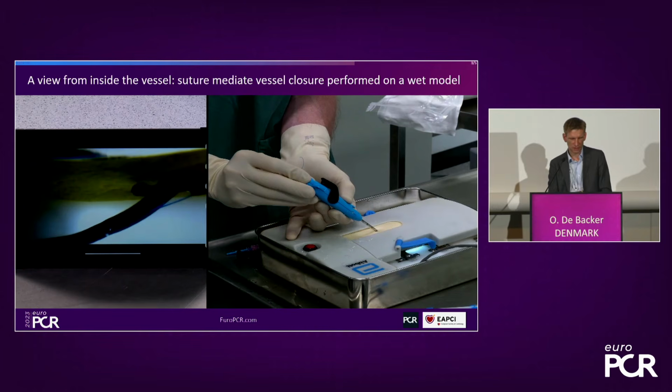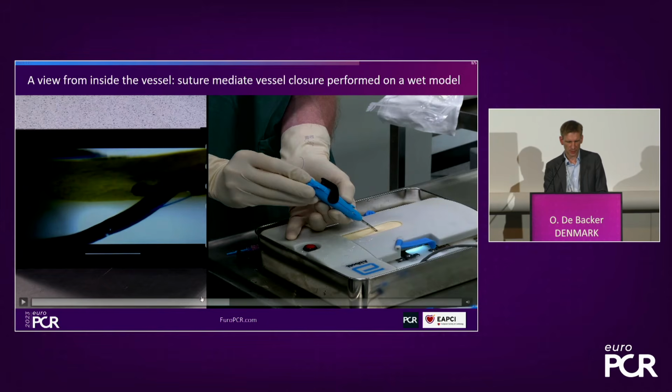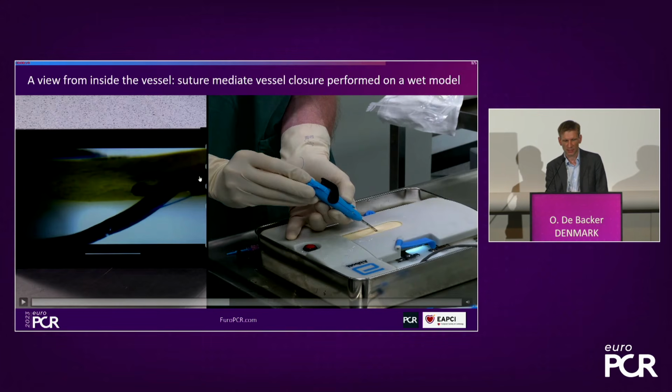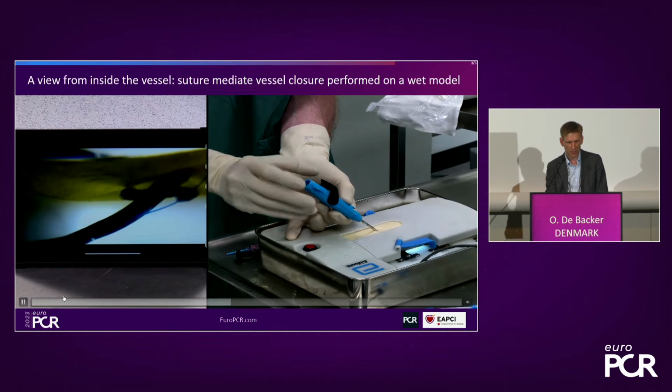What I want to show still on this video, which is interesting, is why people instruct you, once the needles have come out and before you bring this lever down again, to push it 2-3 millimeters in again, intravascularly. Why is that? Because otherwise, if you wouldn't do it, you may potentially damage or hook up in some calcium on that vessel wall. You will see it on the video. I will let it play again. So now I push it a little bit in.